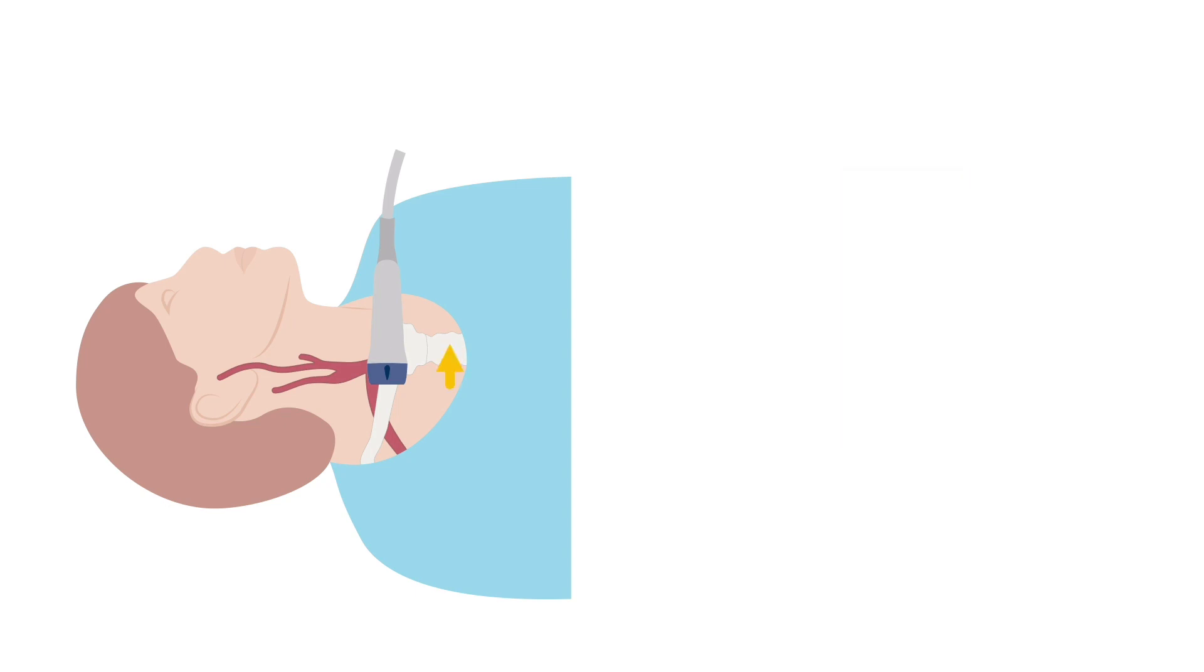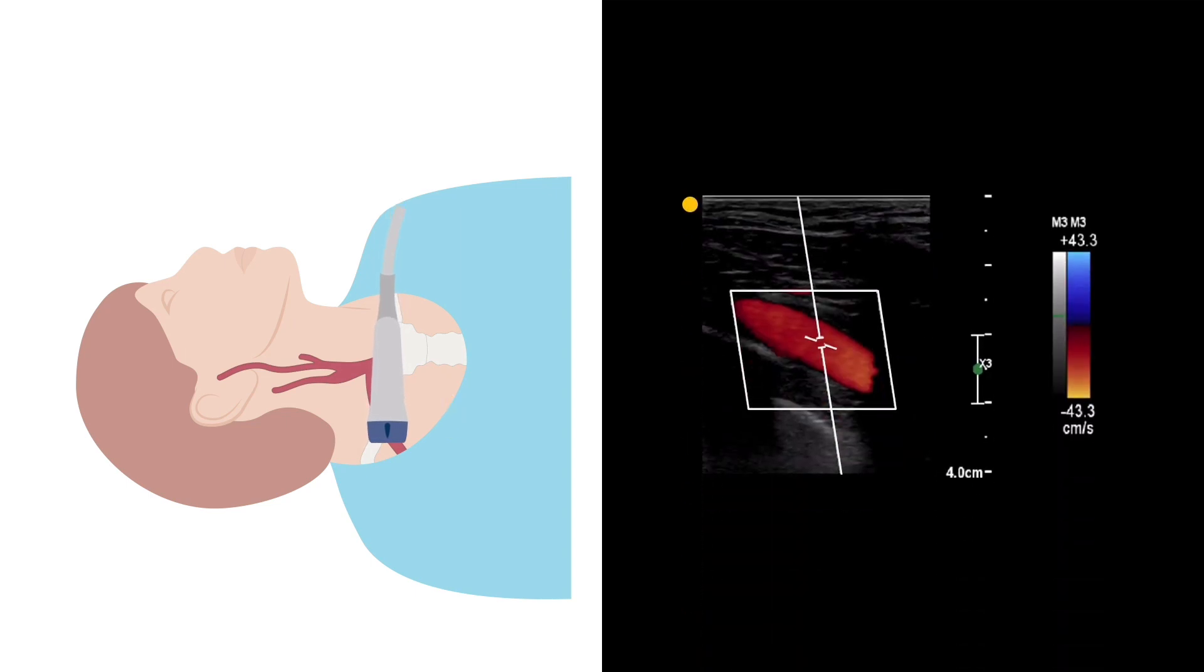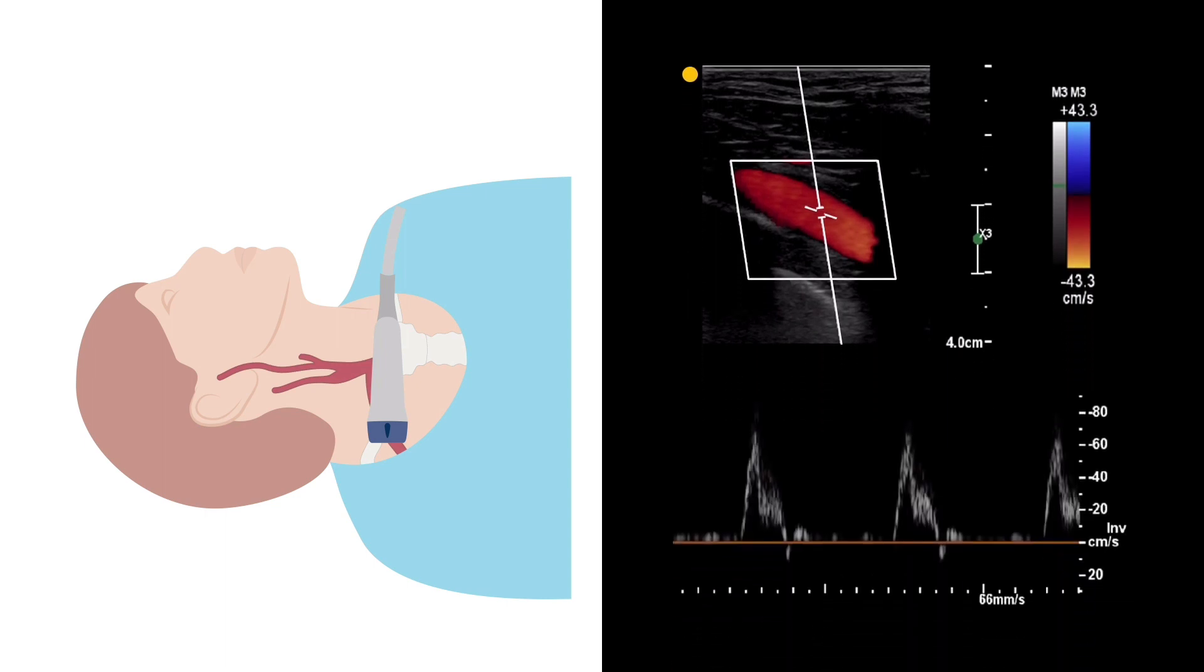Move the probe medially to image the subclavian artery as proximally as possible and then laterally to image the distal subclavian artery. Use the colour flow to help identify the vessel and any areas of stenosis and then make sure to obtain a pulsed Doppler waveform which should have triphasic flow to help identify the presence of significant disease.